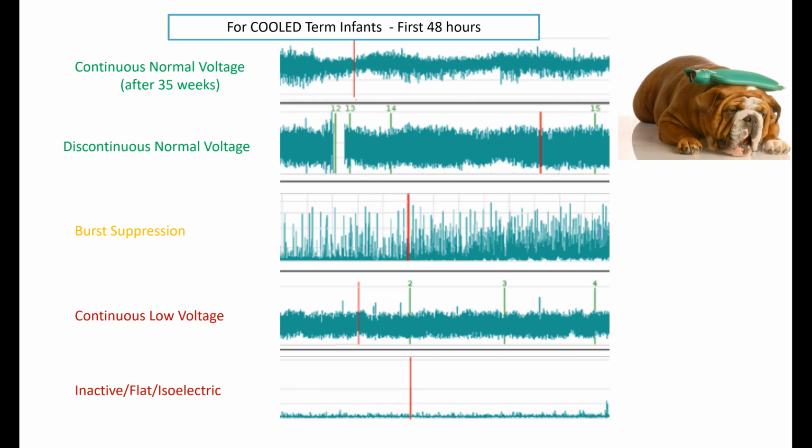How often do the seizures usually start in the HIE babies? It's pretty common still. I think that cooling is a little bit anti-convulsive in the sense that it tends to control seizures a bit, calming down the brain fire so much. But this is why there's that percentage, about 10%, who will definitely seize during rewarming.